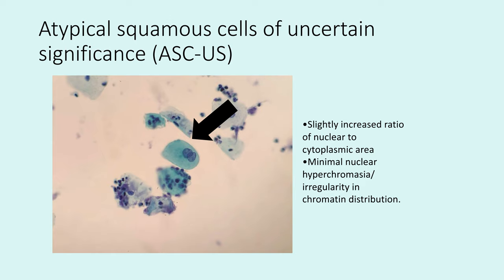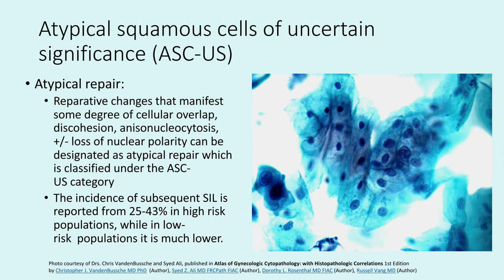Another example is a binucleate cell that looks a little bit metaplastic but is somewhat degenerated. The nuclear outlines are not very irregular, and the chromatin appears more vesicular than clumped. Specific subcategories within ASCUS include atypical repair, which shows reparative changes with nuclear overlap and discohesion, anisonucleosis, and sometimes loss of nuclear polarity. This fits within the ASCUS diagnosis when seen in sheets where individual cells have qualifying changes. In this group, squamous intraepithelial lesion risk can be high in high-risk populations but much lower in low-risk populations.